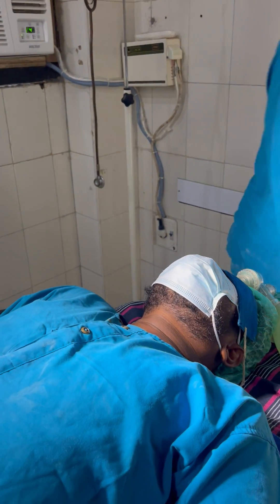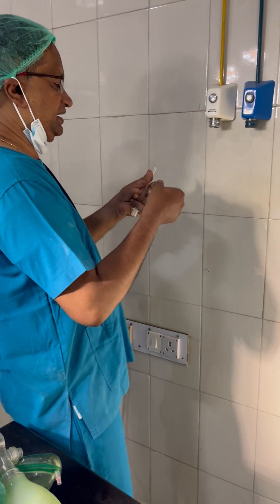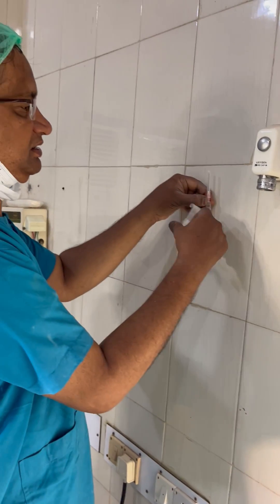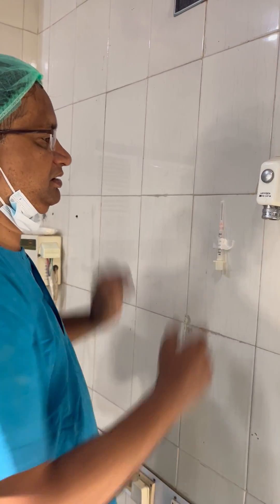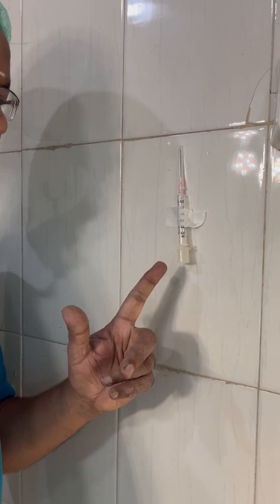In most of the theaters you can keep it like this for emergency and just put it like this. This is emergency equipment which should be plastered like this in most of the theaters. Thank you. Visit me at Faint-Free Partha.